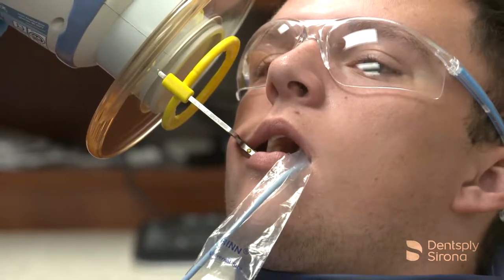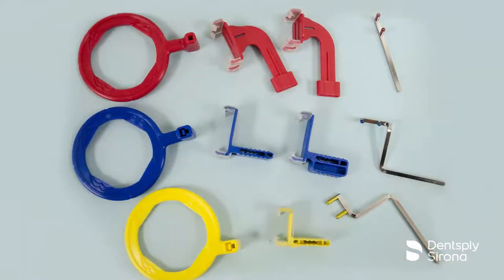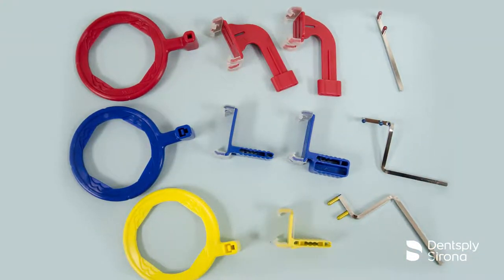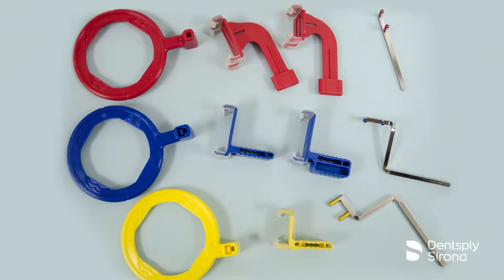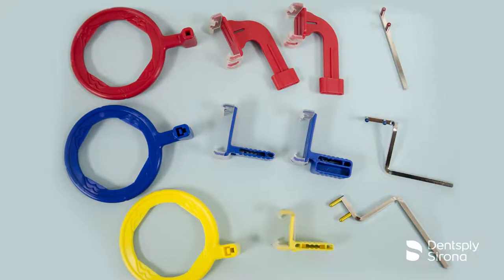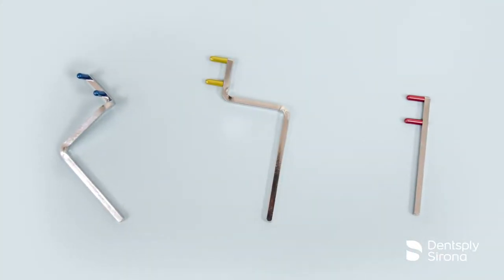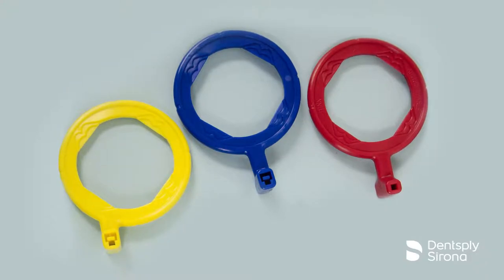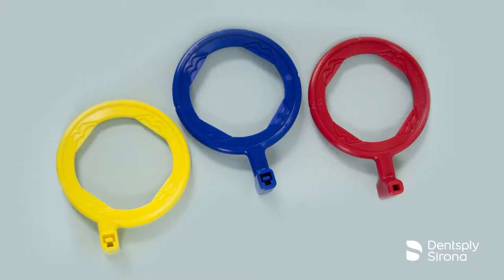The XCP short arm aiming device uses the XCP DS-FIT universal sensor holder and the traditional arm and ring sets, which consists of three metal arms and three color-coded rings corresponding to the area they will be used in the mouth.